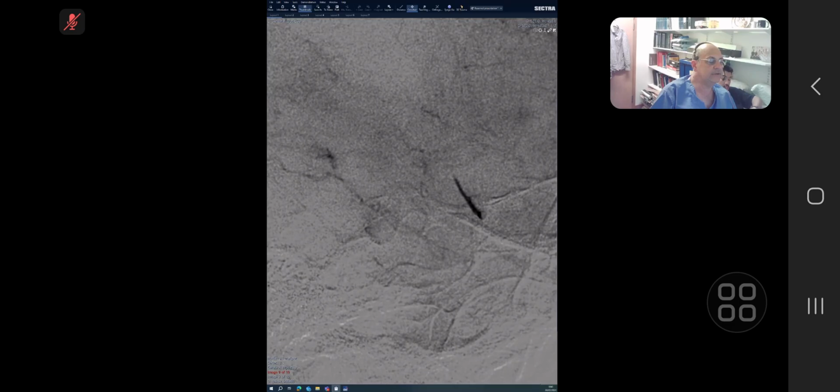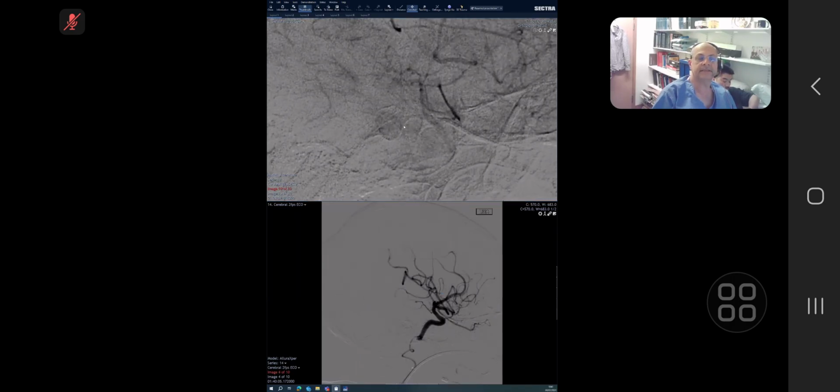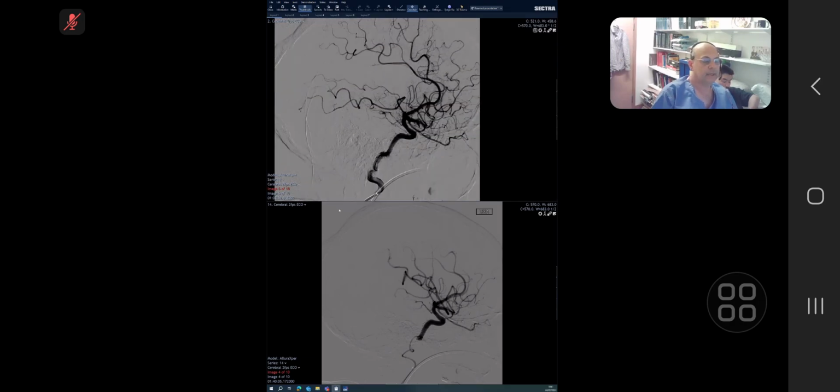So we went in and we took out the clot from this area, and at the end this is opened up. You can see the branch has come back in comparison to the pre-procedure. So you can see. Okay, so you got this right?